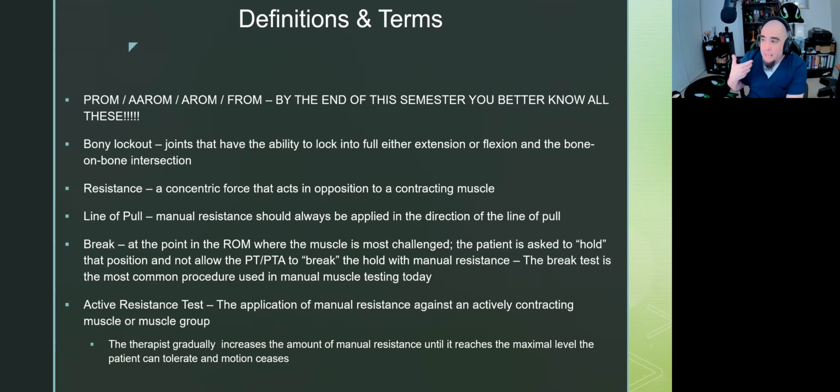If you're interested in getting into therapy that deals with work hardening or improving work conditions and stuff like that for patients, you'll see a lot of these isokinetic machines.